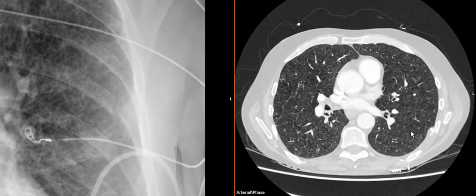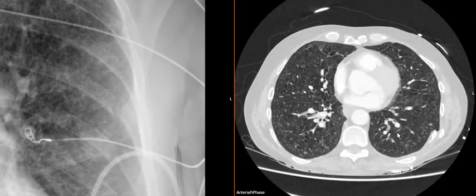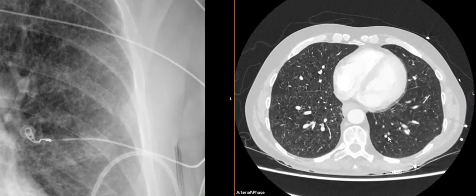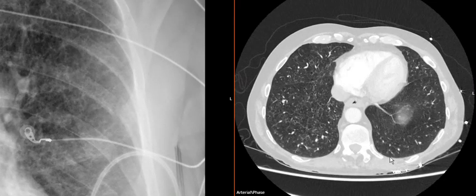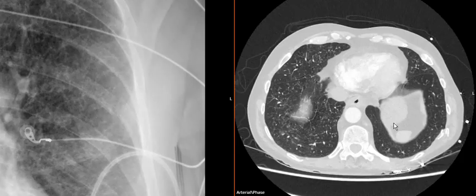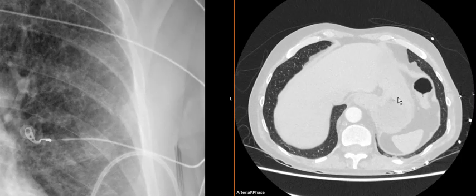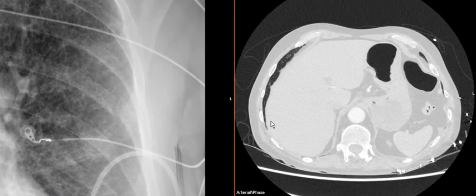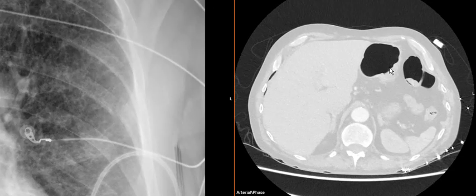So as we work our way down, there looks problematic. So I think he'd had a fall and some rib fractures. There's a gap there. But no obvious bleeding or anything into the pleural space. And then coming up under, this is the left side, and under your diaphragm on the left is your stomach, and the spleen at the back, and then on your right is your liver, and there's lung all the way down there. And then gas in the stomach and gas in the bowel, but it's contained.